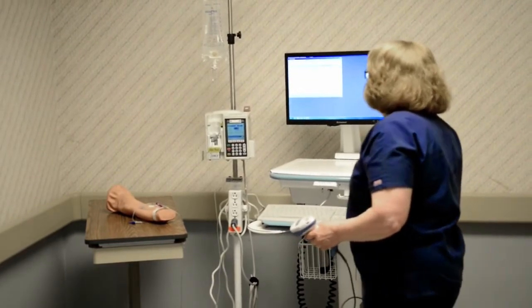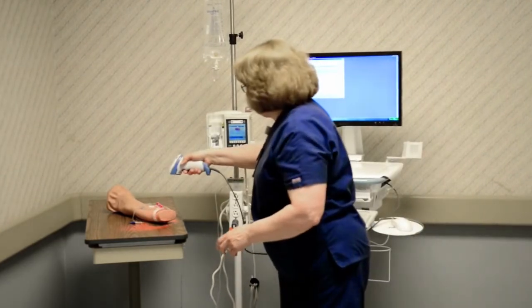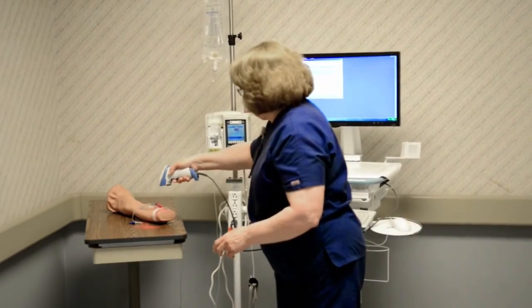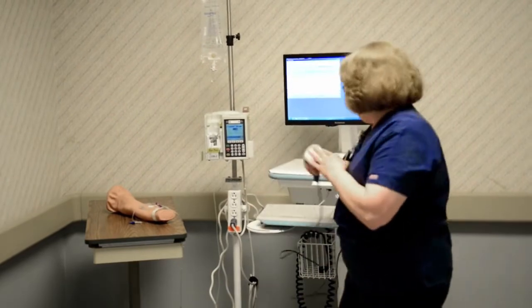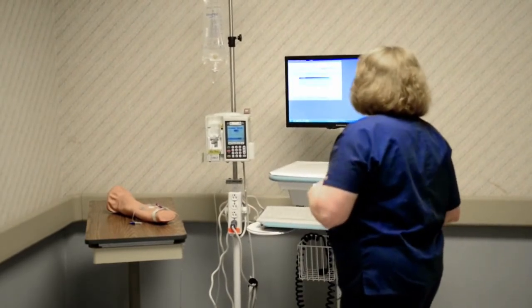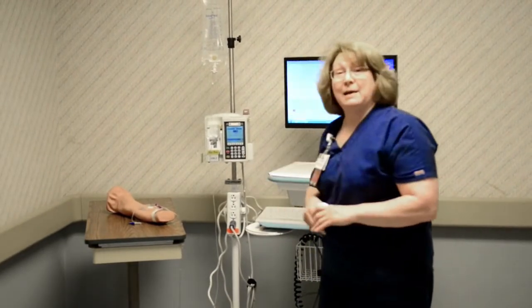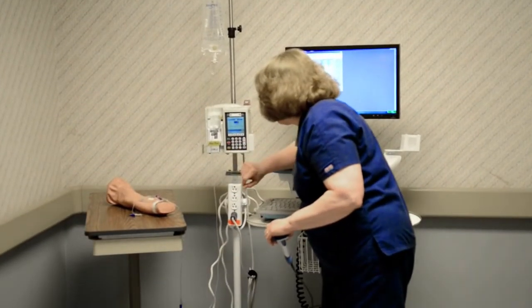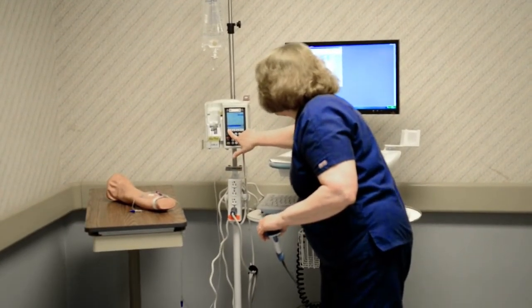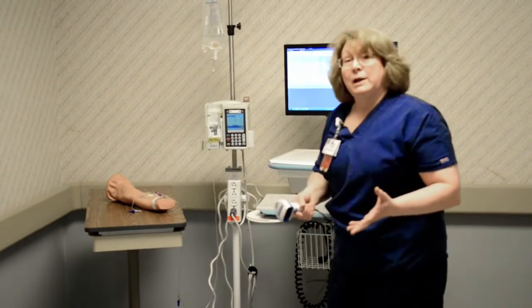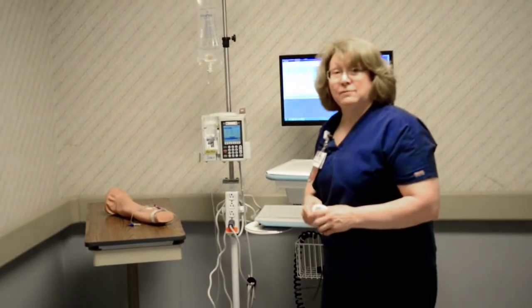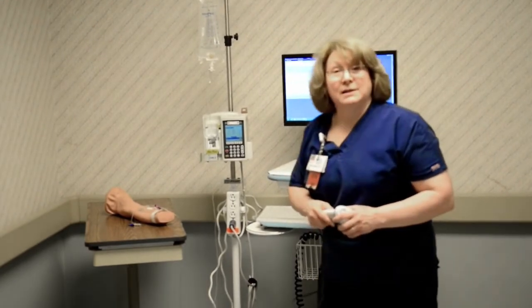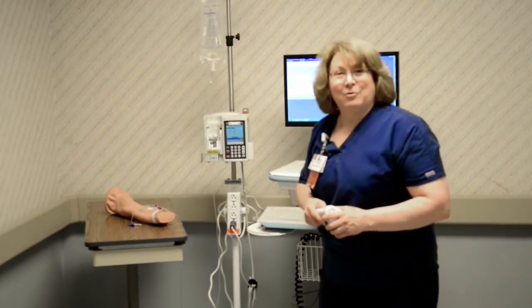I hit submit, I scan my patient, and then I scan myself. I then turn back to the pump, make sure that everything is correct according to the physician's order. I press start, and then I press yes. So at this point, if I had a piggyback or another medication to infuse, I would do the same process for that. Thank you and have a great day.